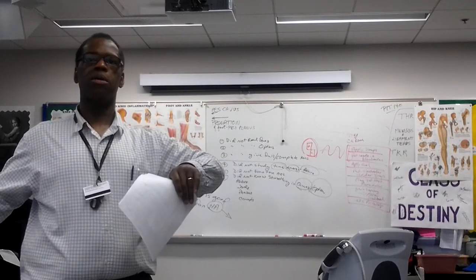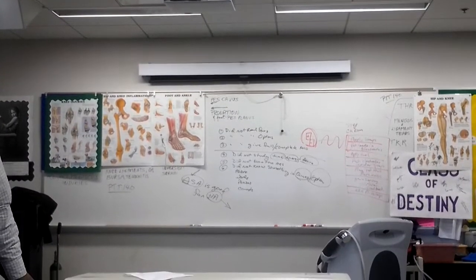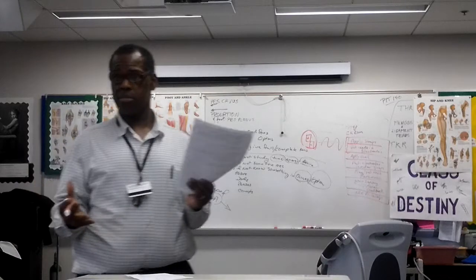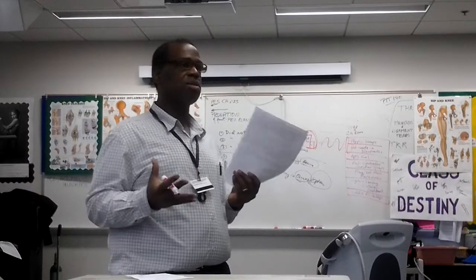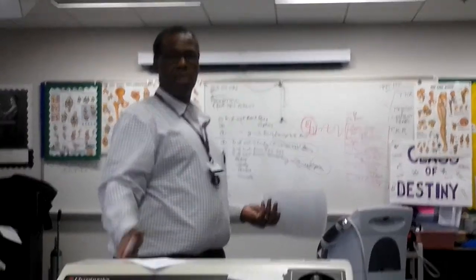Reduce the pause. Let them get used to it. Come back and turn it up. Let them get acclimated to the treatment. Let them get accommodated to that. Sometimes you can't quite get what you want the first time. But if you come back, let them get used to that, then you can do that. Good. All right, treatment time.